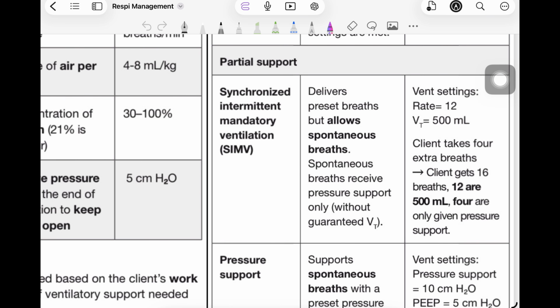So, bakit ginagamit ang SIMV, guys? Dito, guys, gusto kasi nating malaman kung yung pasyente ay nakakapag-breathe na independently, or yun yung tinatawag natin na pwede na natin siyang i-wean. So, kung under weaning na si patient, ang pwedeng mode na gamitin na natin dyan ay SIMV. Weaning, ibig sabihin, konti-konti na natin siyang tinatanggal sa paggamit ng machine or ng ventilator.